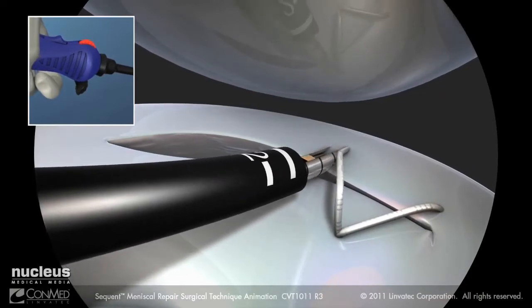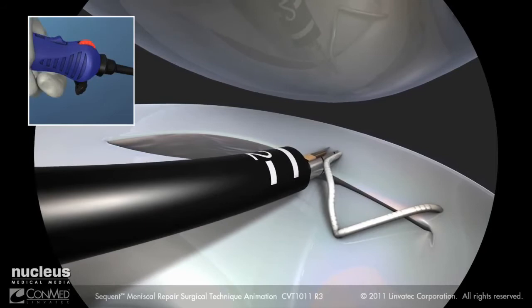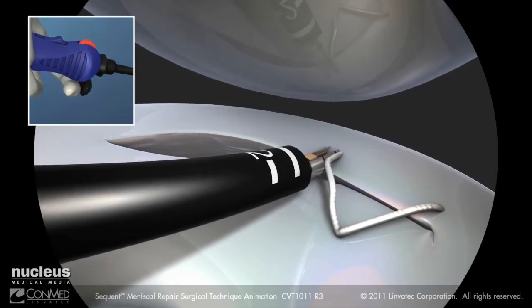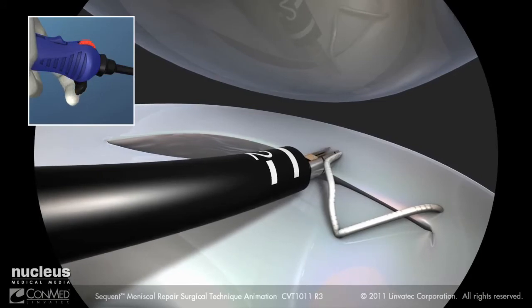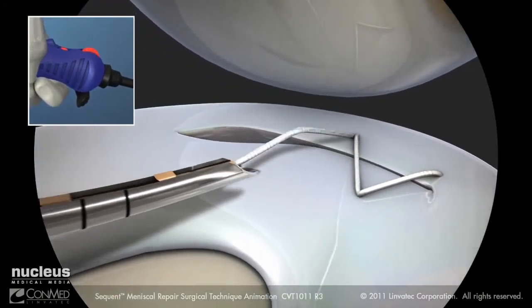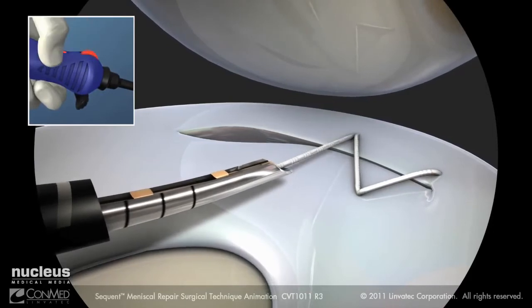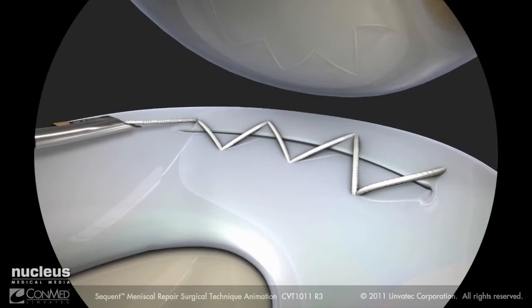Pierce the meniscus. Rotate the device twice. Advance the trigger to reset. Pull and release the trigger to deploy an implant. Withdraw the needle from the meniscus and tension the stitch. Continue creating sequential stitches until the meniscus running repair is complete.